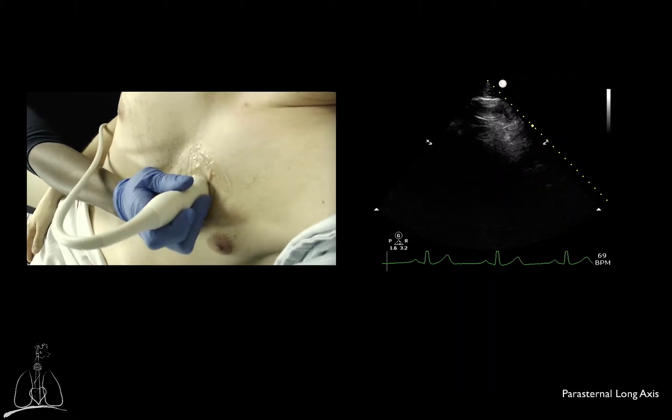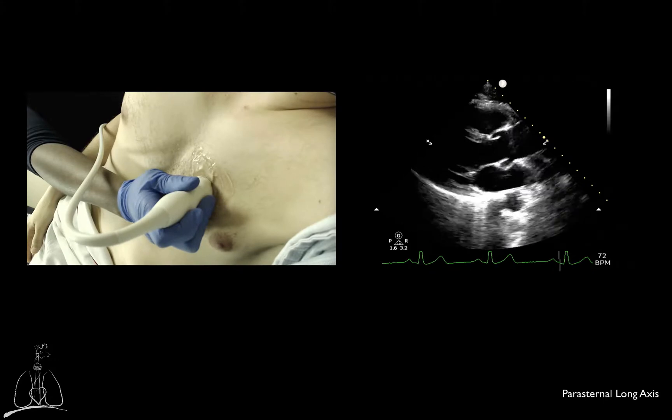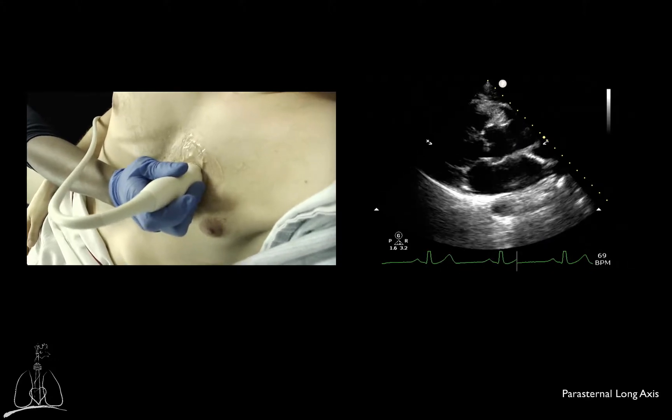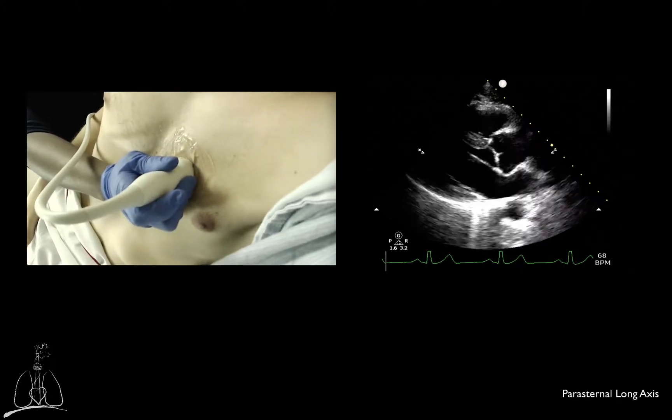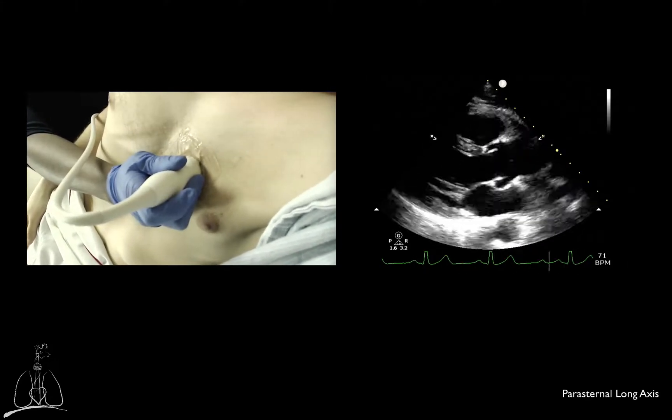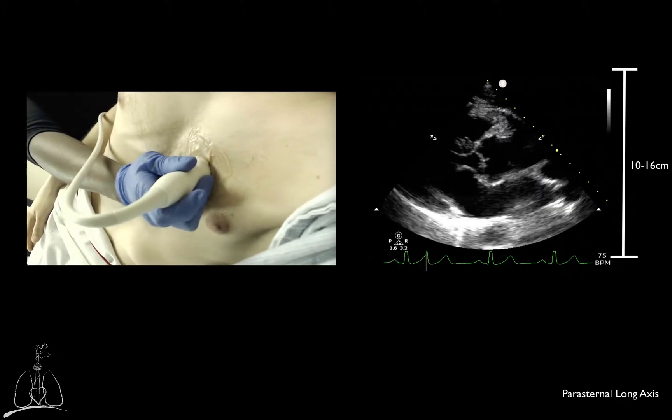Subsequently, you will decrease the depth to focus on cardiac structures. Usually the depth will be set between 10 and 16 centimeters.